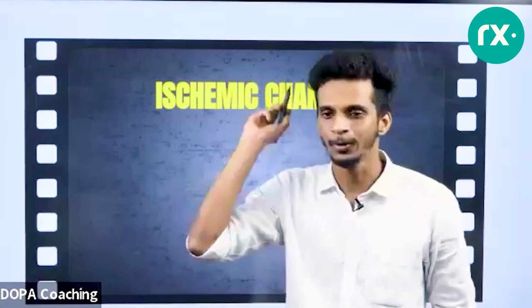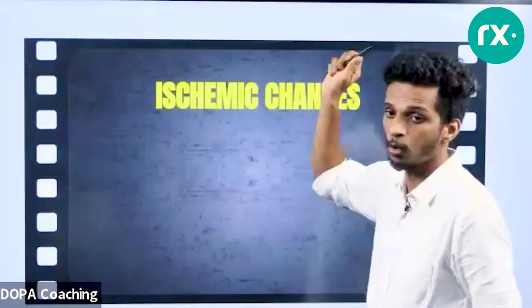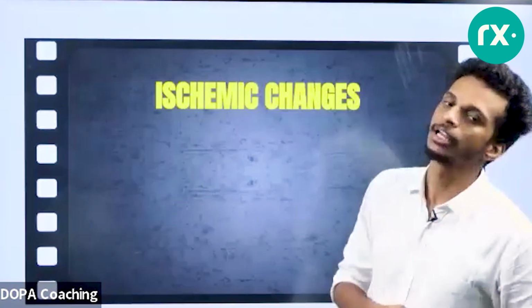This is the most important thing you need to know whenever you get a new ECG. Whenever you get an ECG, this is the most common scenario you are going to have when you start practicing. So let's speak about ischemic changes and arrhythmia. If you are well versed with ischemic changes and arrhythmia, it's perfectly fine for you to practice. You're not going to kill a patient.